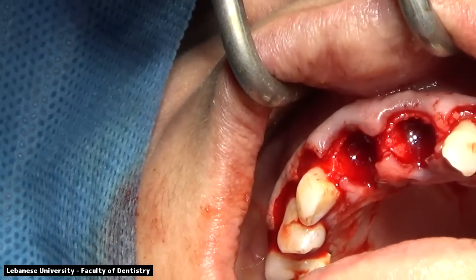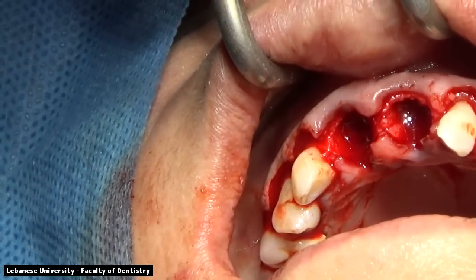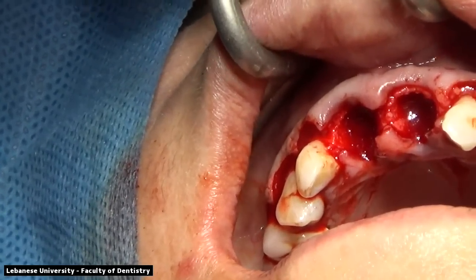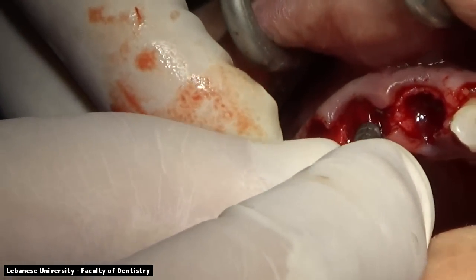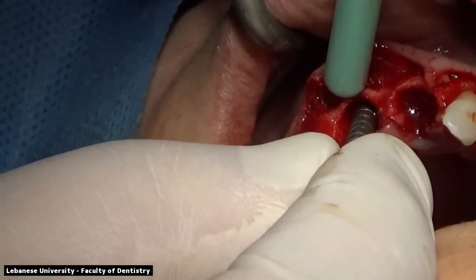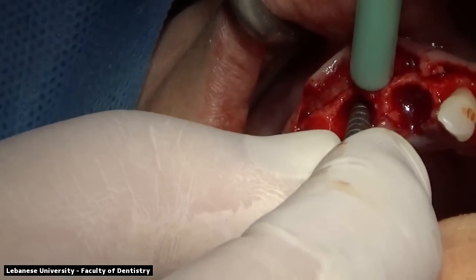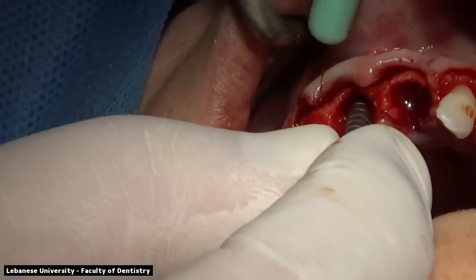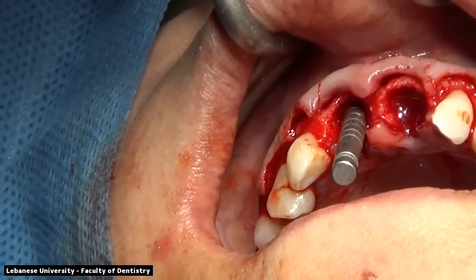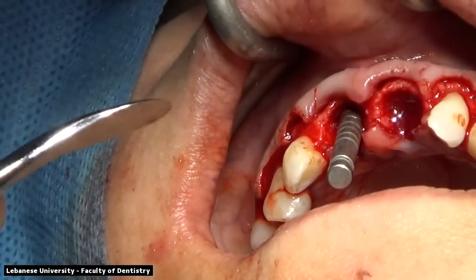So what we're doing now is we're using the guide to check if we're going to place a 4.1 millimeter implant, or we're keeping it as a 3.3 millimeter implant. After placing our guide, we noticed that we do not have enough gap between the buccal and the implant to place the bone. So to prevent the collapse of the buccal plate of bone, we decided to keep it at a 3.3 diameter implant.